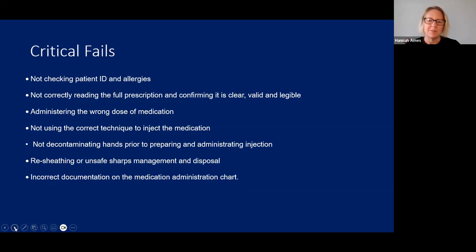Not decontaminating your hands prior to preparing and administering the injections. That's really important, as is removal of PPE, but we must demonstrate good hand hygiene. If you resheath your needles or do any unsafe sharps management or disposal, that will be an automatic critical fail. And like with all your stations, incorrect documentation on the medication chart will also be a critical fail.